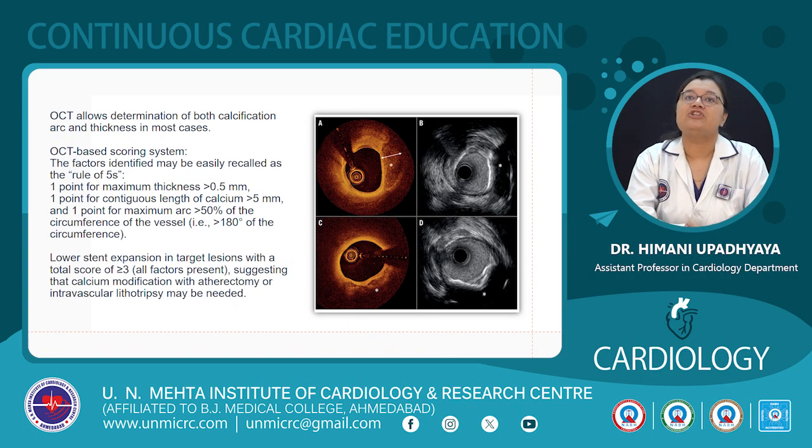OCT allows determination of both calcium arc and thickness in most cases. The calcium thickness is not very well defined in IVUS, but in OCT we can see it. The OCT-based scoring system for calcium is called the rule of 5.